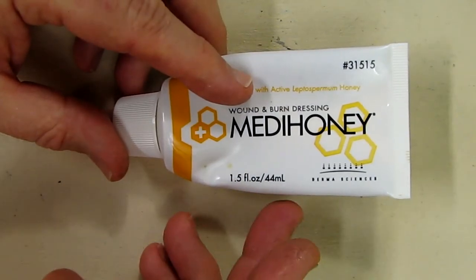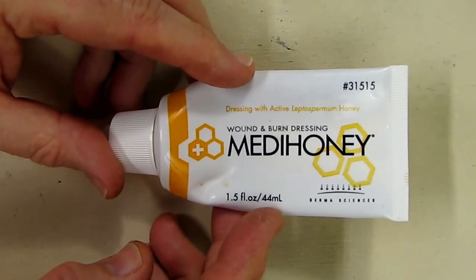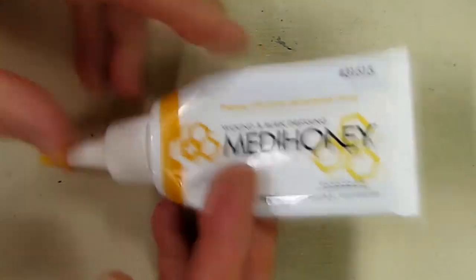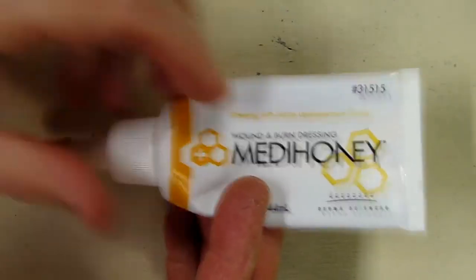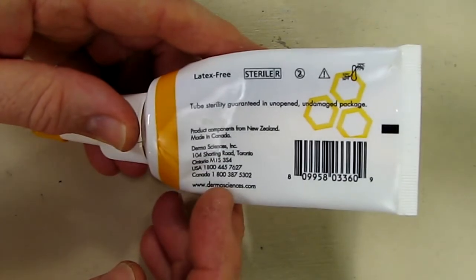This is a 1.5 ounce, 44 milliliter size, and I've been using this now for a couple months. It lasts a long time. It has a very tight fitting cap on there, and an expiration date is on there also, and the company information is on the back.